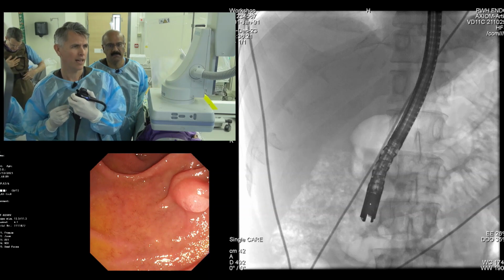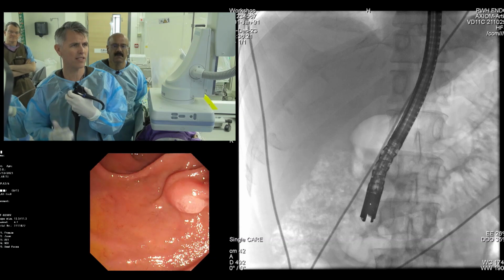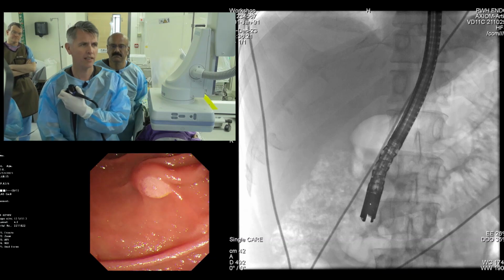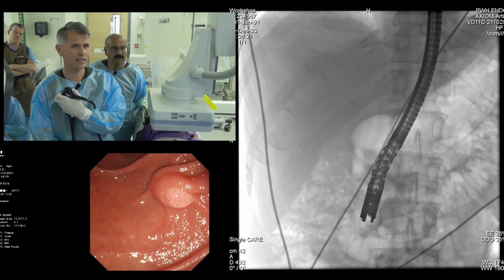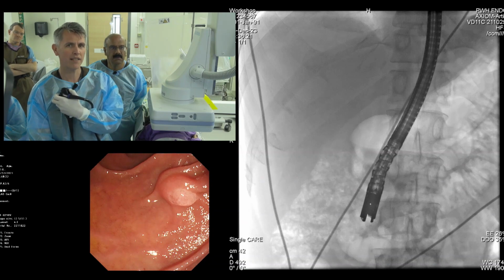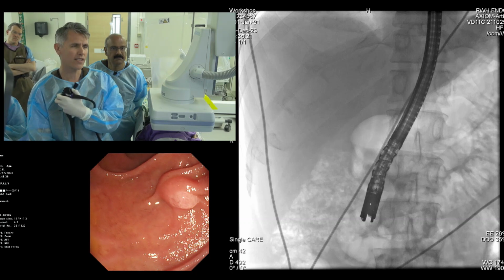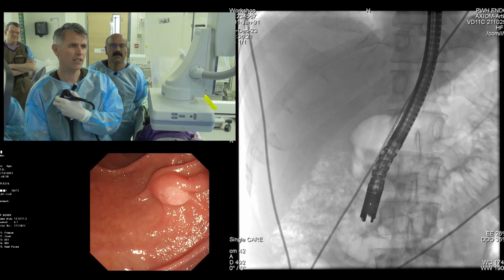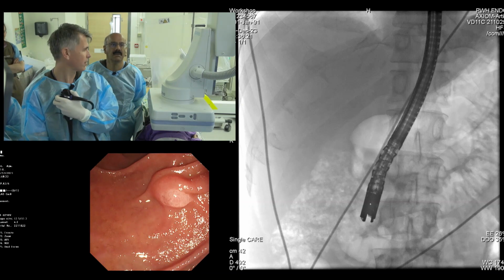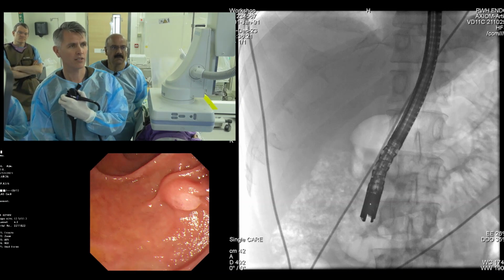Our plan is now that first, the patient has not received ERCP yet, so we have to cannulate the pancreatic duct, and then the second challenge is to pass the guide wire alongside. Then after pancreatic sphincterotomy, the best we can achieve would be that we can at least decompress the duct upstream of the stone here.